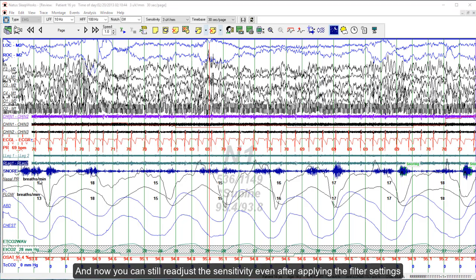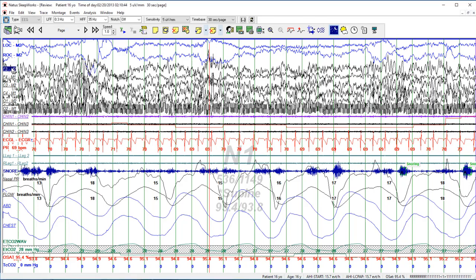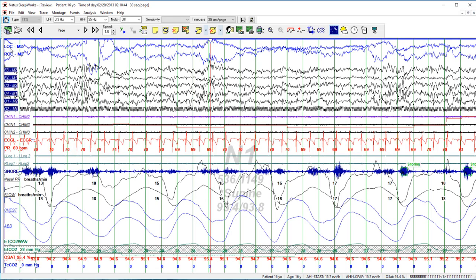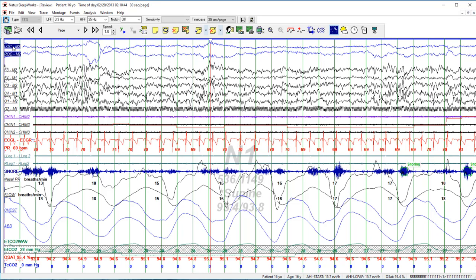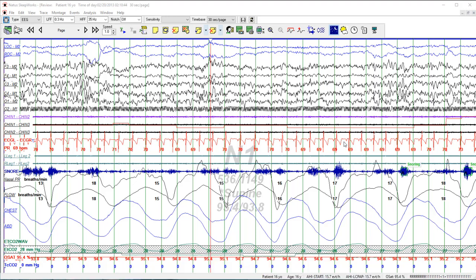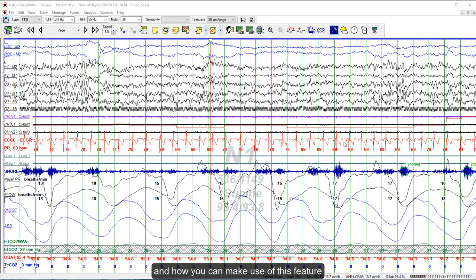You can still readjust the sensitivity after applying the filter settings. Next, I'm going to show you how to create a split screen or two views in the Sleepworks software, and how you can make use of this feature.